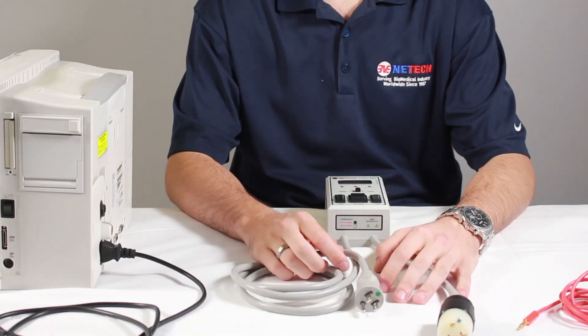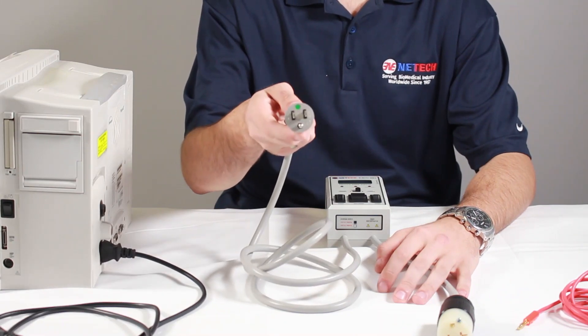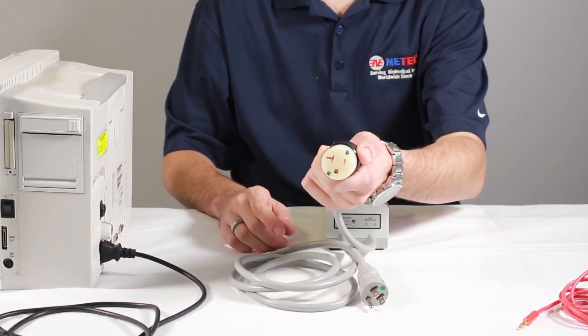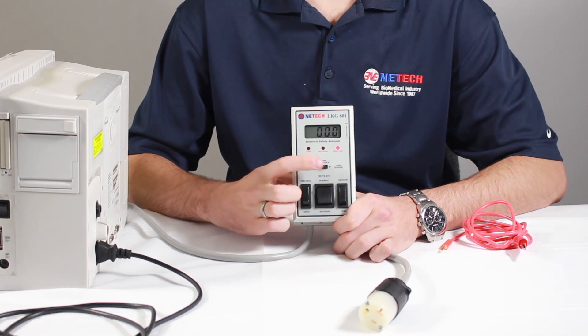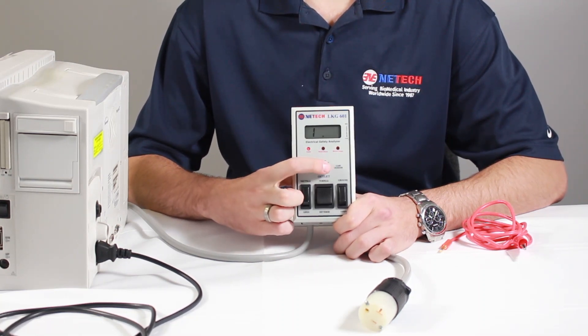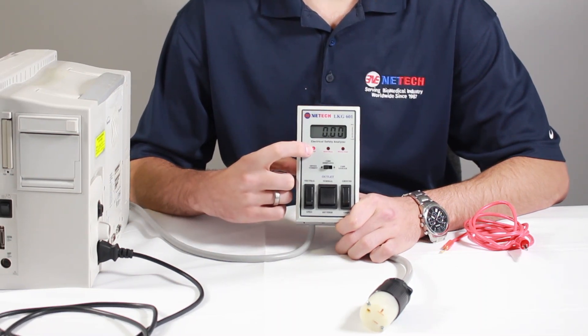Below the LKG601, you'll notice there are two cables: a hospital-grade power cord and a 20-amp power test receptacle. The LKG601 has a three-position slide switch that allows you to choose between case leakage, cord resistance, and device current. A lit red LED will indicate this selection.